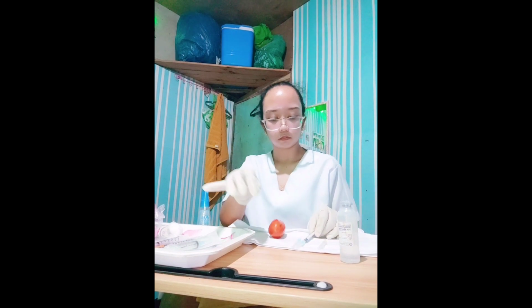So next, we will remove the needle cap, pulling it straight off. And we will hold the syringe between the thumb and middle finger of the dominant hand.